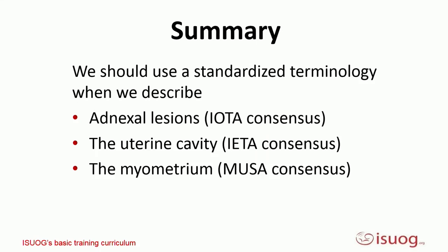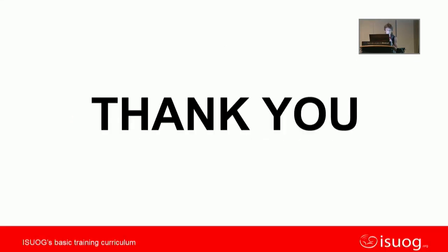And we should use a standardized terminology when we describe ultrasound images of adnexal lesions, the IOTA consensus statement, of the uterine cavity, the IETA consensus statement, and of the myometrium, the MUSA consensus statement.